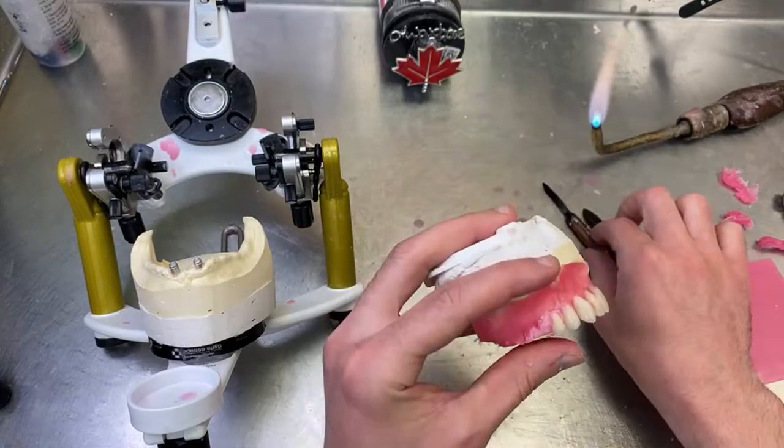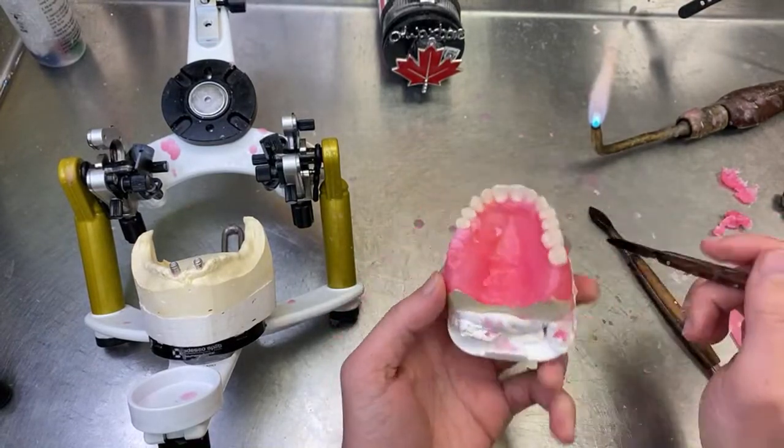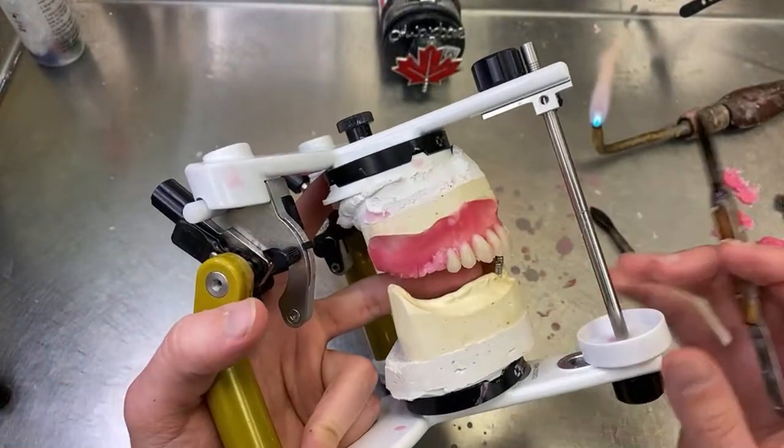So same thing goes on that side, making the teeth straight, the cusp is straight, and the line, and also check on the articulator, and you'll see.